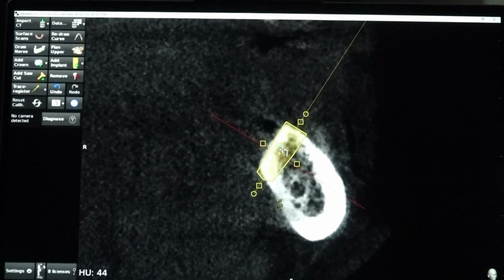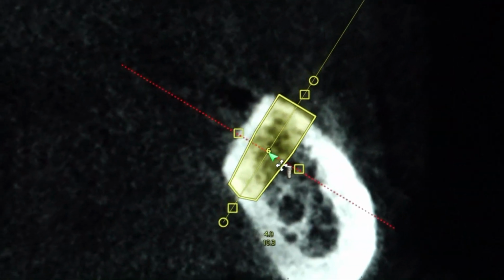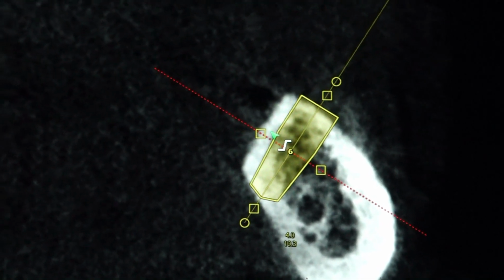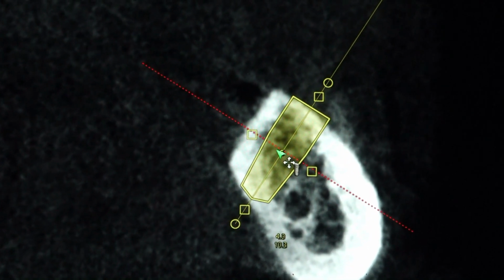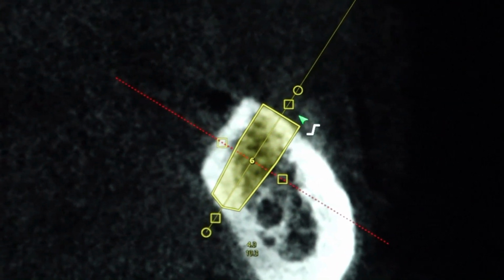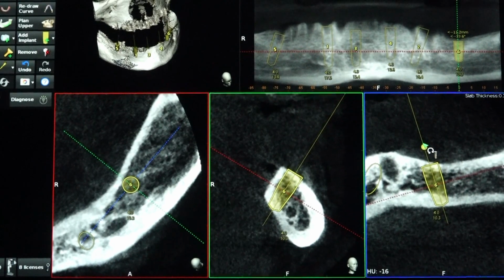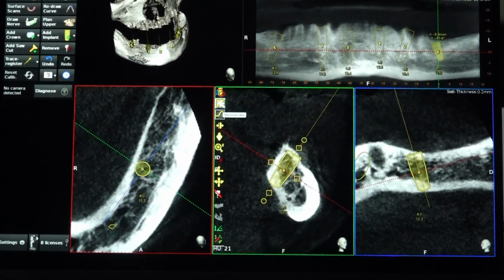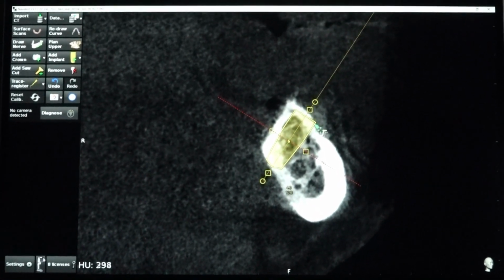See, the most common mistake is drilling close to the lingual plate. There will be thin bone remaining on the lingual side, risking bone loss and risking fracture while bending. Okay, we have to leave sufficient lingual bone and drill it. See the angulation. A slight distal tilt will do a lot of good. Okay. See here till this depression comes.